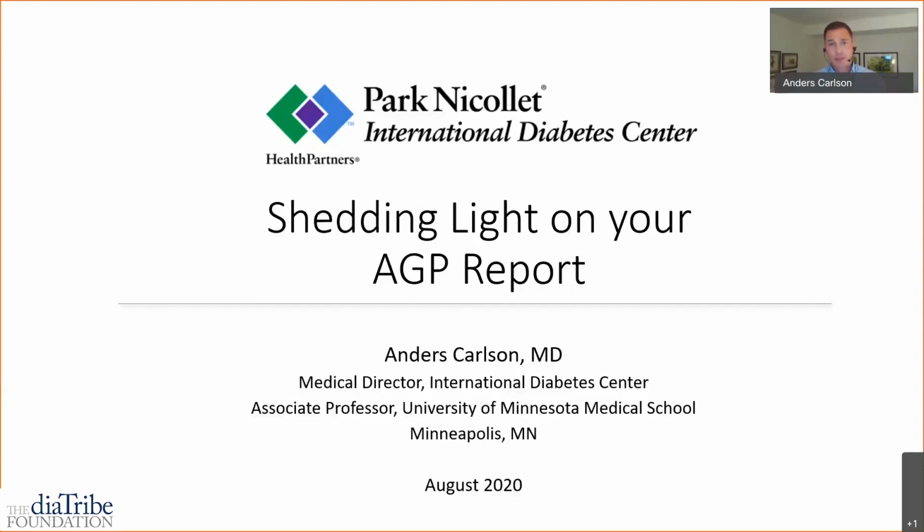And I'm thrilled to be with you today to talk a little bit more about how we can use the AGP report to help you achieve better glucose outcomes. And so thank you to the diatribe community and thank you for all the work you do in this space.